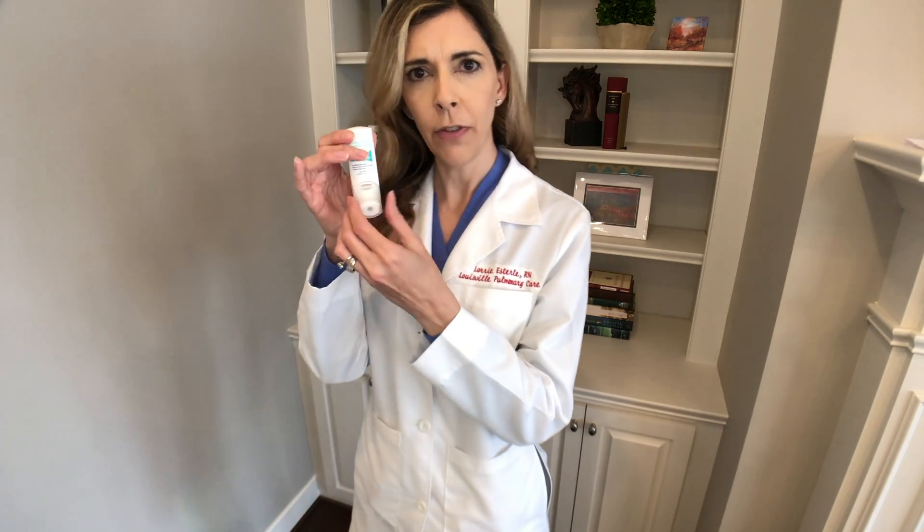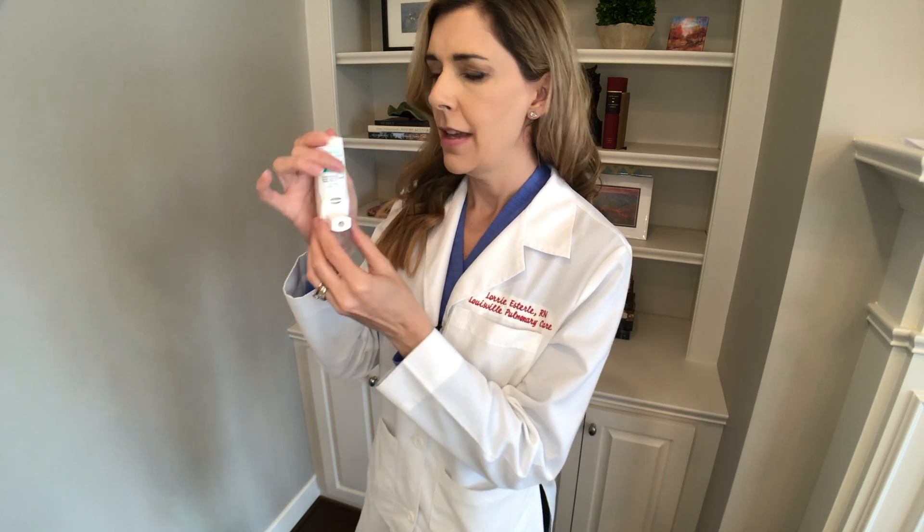First, you need to remove the cap by pulling down and you'll hear a bit of a pop sound. Before you inhale, you want to blow the air out of your lungs.